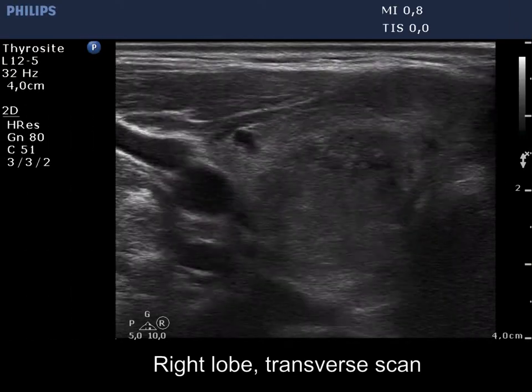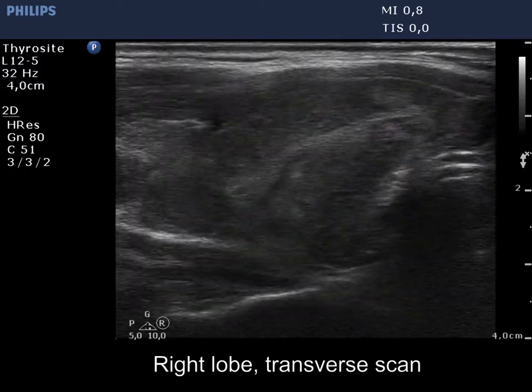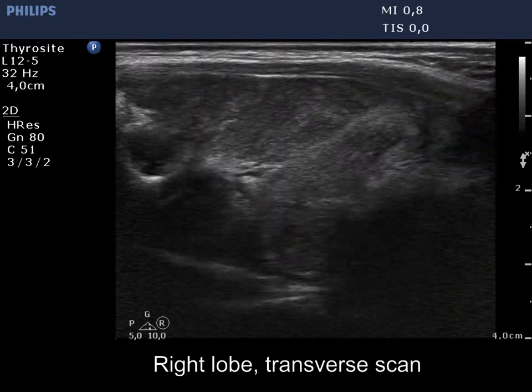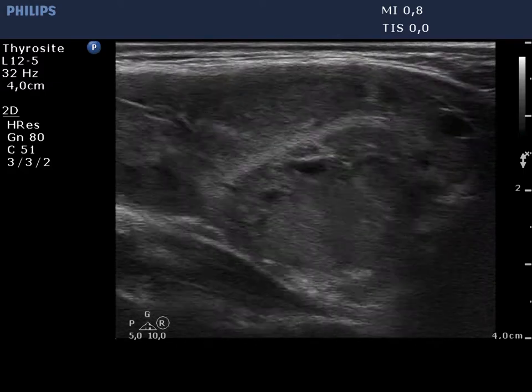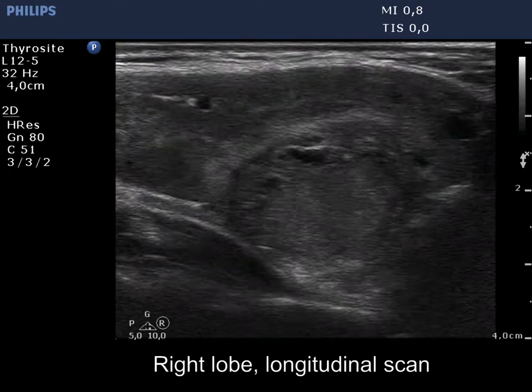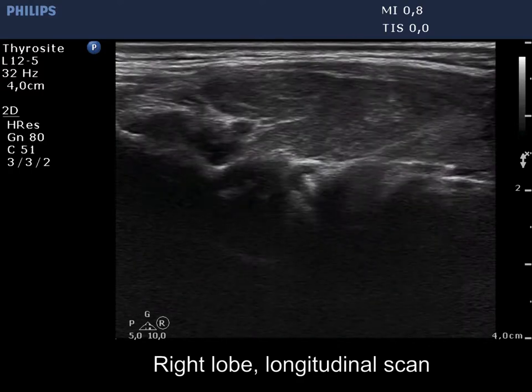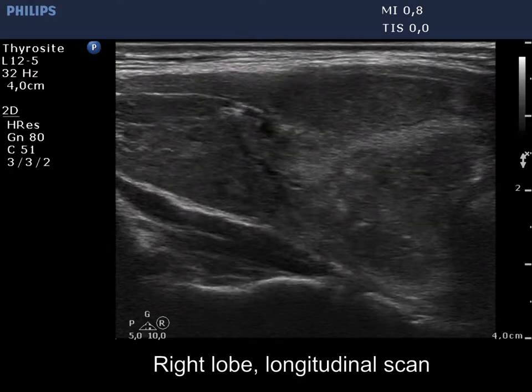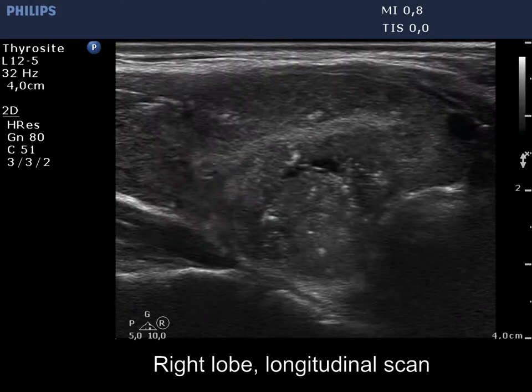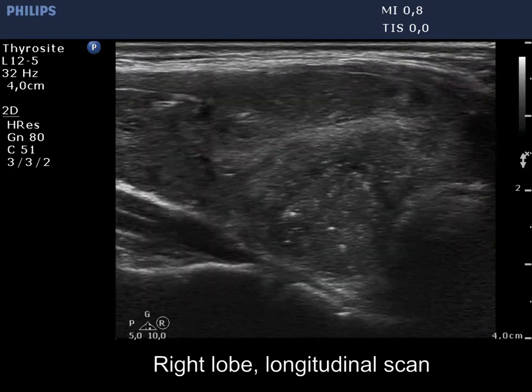The right lobe is composed of large hypoechoic areas divided by fibrous tissue. In contrast with other fields, the lesion in the lower dorsal part is more inhomogeneous and contains punctate echogenic foci.